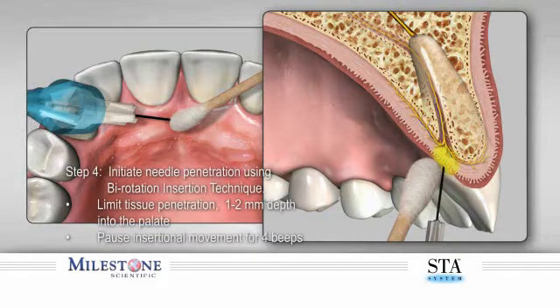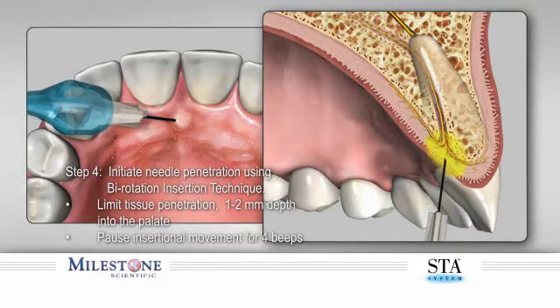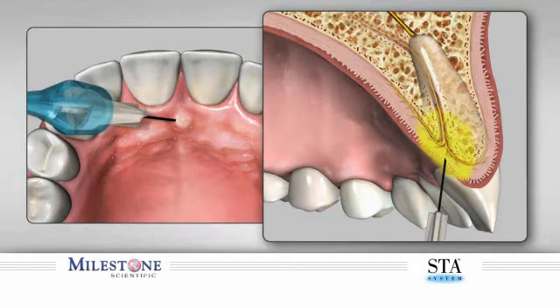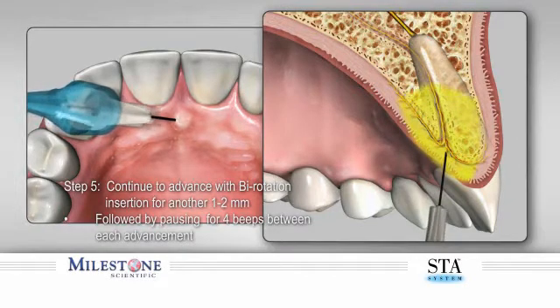Step 4: Rotate the handpiece back and forth with a slight forward movement to allow a shallow puncturing of the tissue to a depth of 1-2 mm. Then stop forward movement to allow the STA system to continue to deposit anesthetic for an additional four beeps before any further penetration of the tissue. Step 5: Continue to very slowly penetrate the palatal tissue with a gentle back and forth movement, while simultaneously advancing another 1-2 mm before pausing once again.